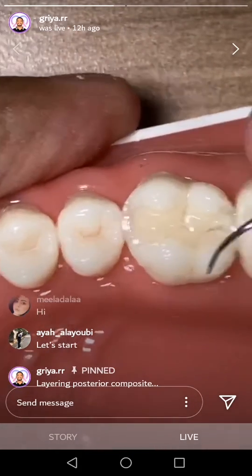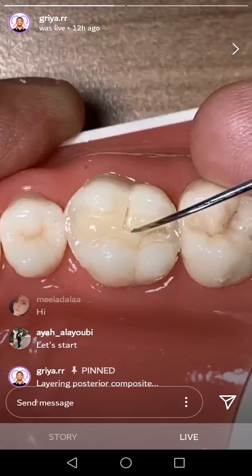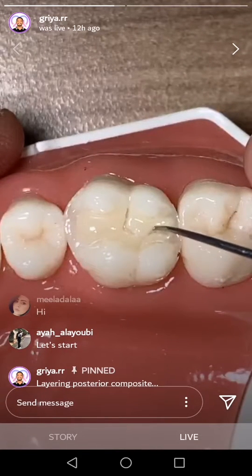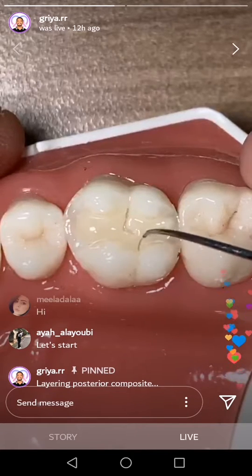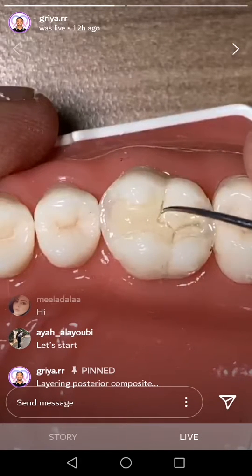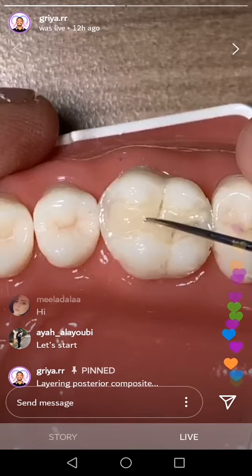Okay, wait. Okay, you can create again, because usually I'm using my file. Okay, we need a sharp instrument doing like this. Okay, and this is another line. Okay, like you can push like this.